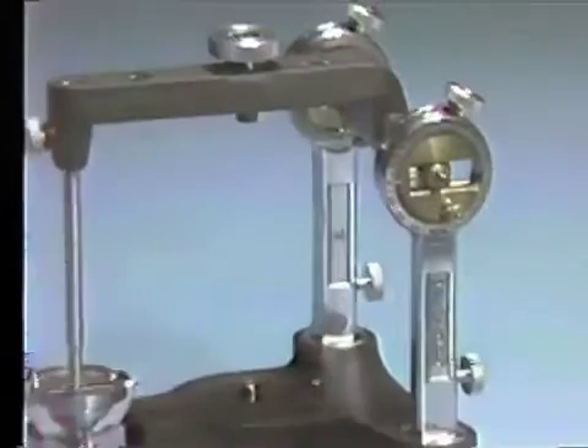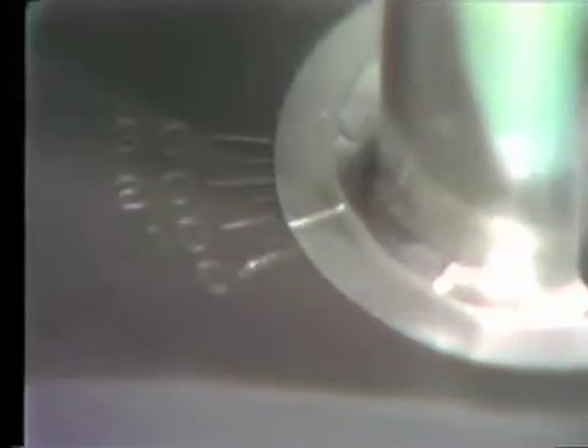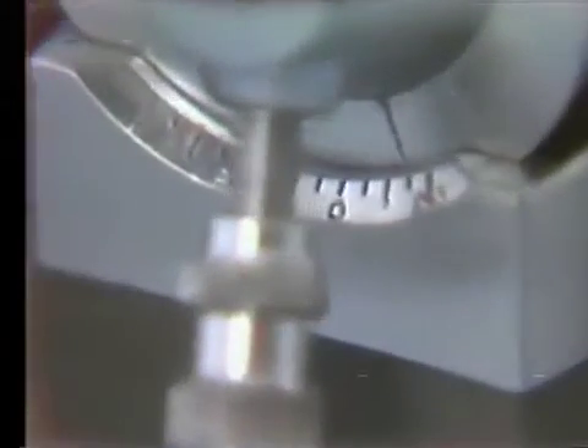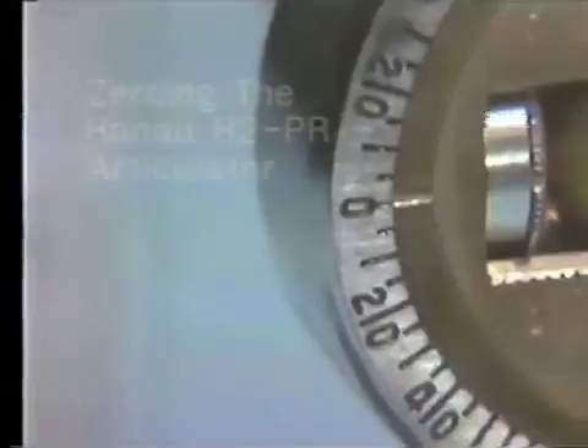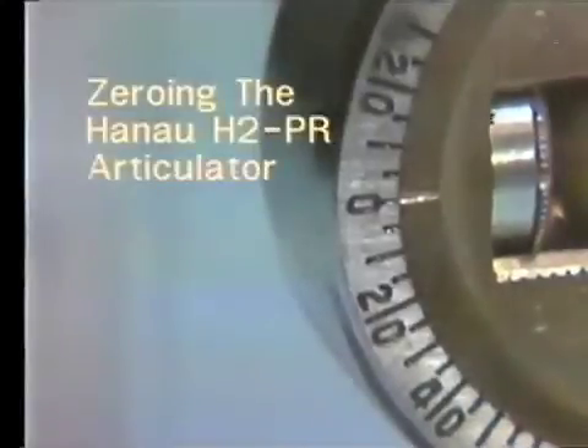It is important to check the instrument to make sure its adjustable components move easily, are free from plaster, dirt, and excess oil, and to make sure all the components are placed on their zero settings bilaterally. To zero the H2PR articulator, nine adjustments must be checked to read zero degrees. The incisal pin must be centered anterior-posteriorly and laterally, and all the thumb screws and thumb nuts must be locked by hand.